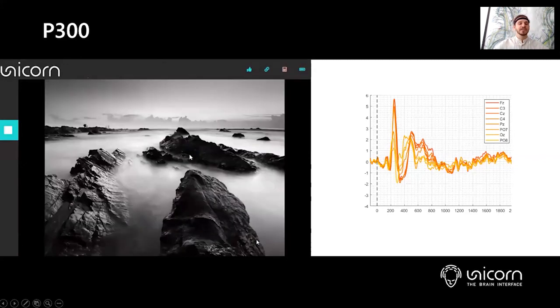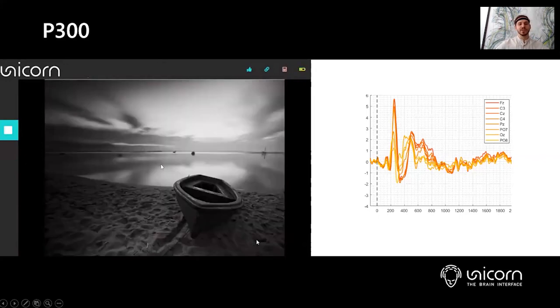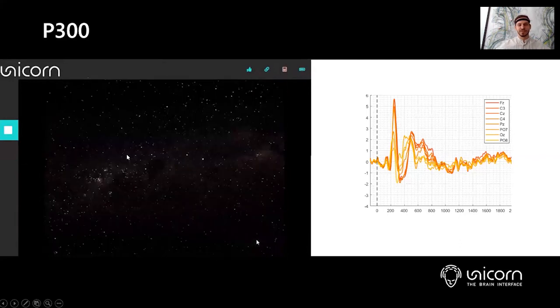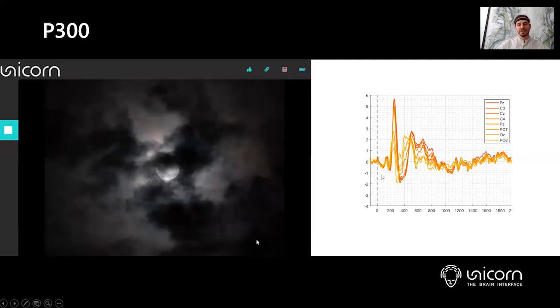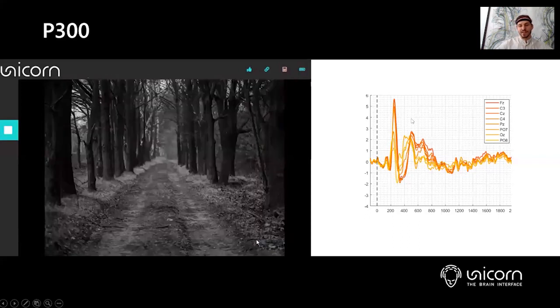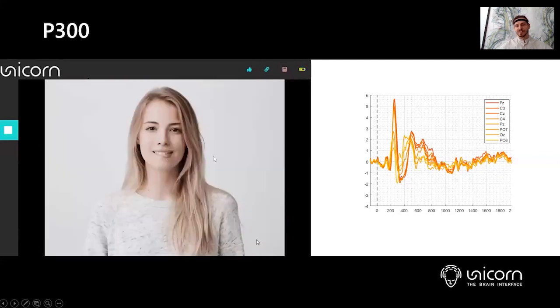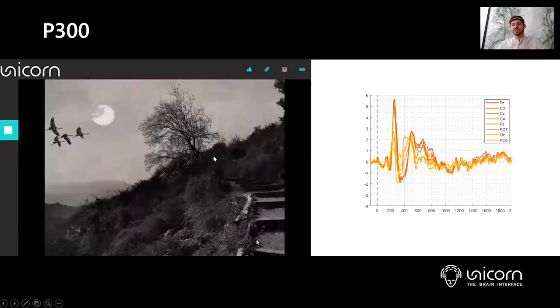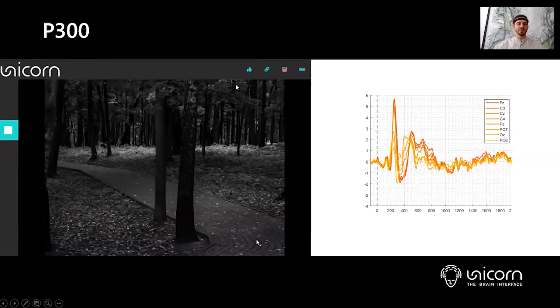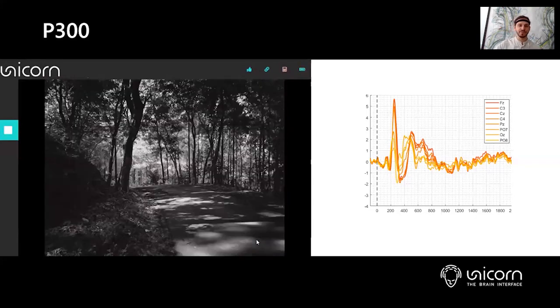So your brain is trained to detect faces. And whenever the blonde lady is appearing, some attention is triggered in your brain. This is called the P300 or VEP, because you can see that there's clearly a peak, and that's meaning that you're paying attention to something. So that's a signal that we can use and collect with the Unicorn system, for instance.